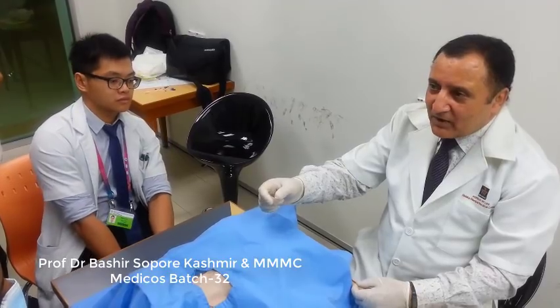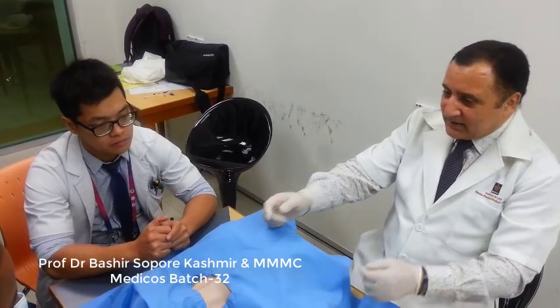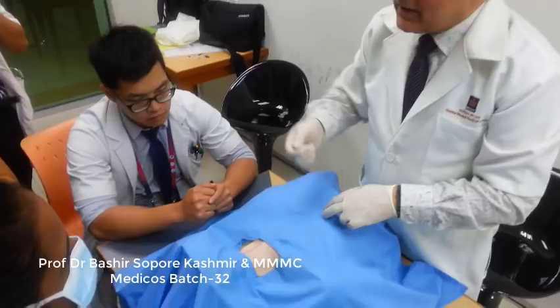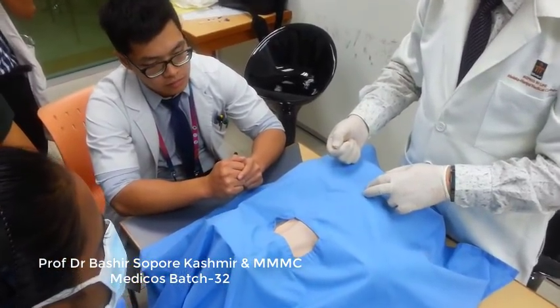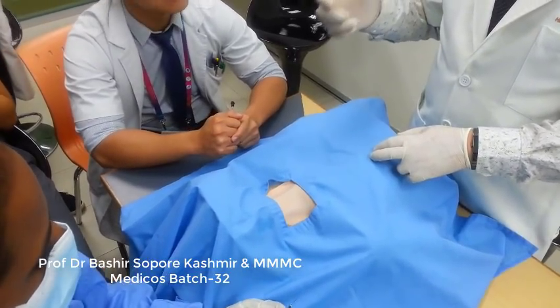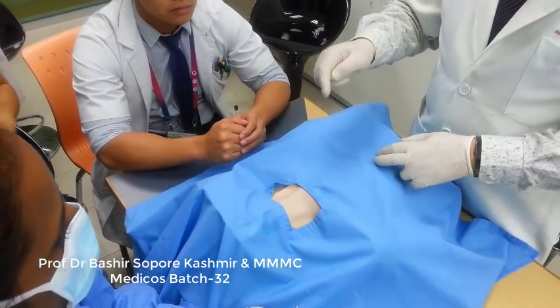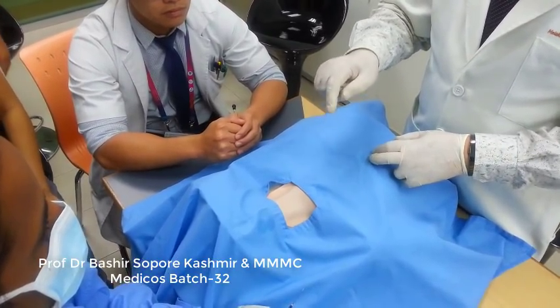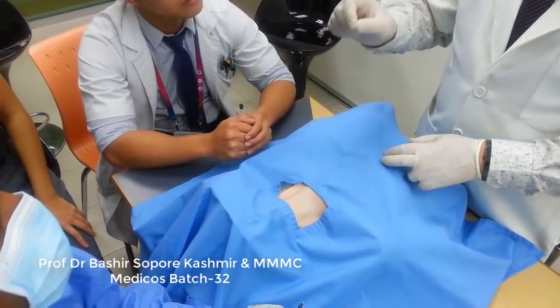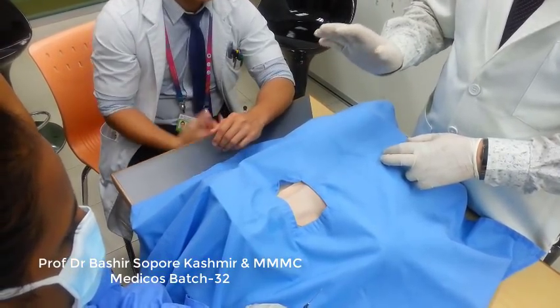Its distance is from 0.5 to 2.5 centimeters. In this distance you should find the vein. If you are introducing too deep a needle, is that correct? That is not correct. That is going to injure the tissues and vessels. This knowledge should be in your mind: the jugular vein is superficial, it is lateral to the carotid artery, and it is only 0.5 to 2.5 centimeters deep. You got my point? This should be in your mind.